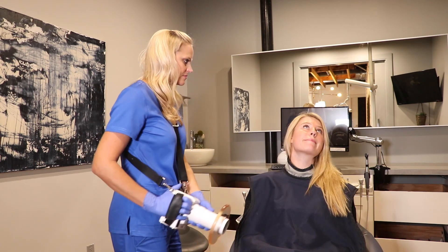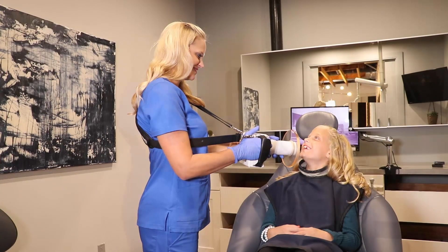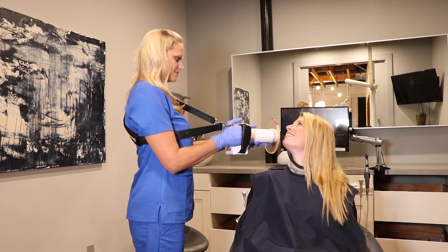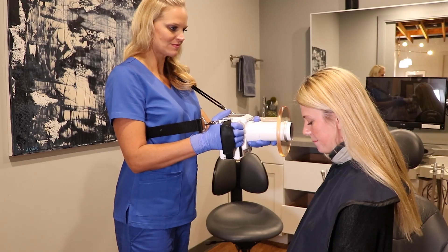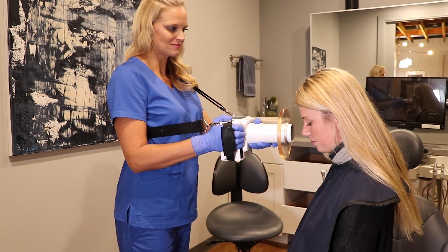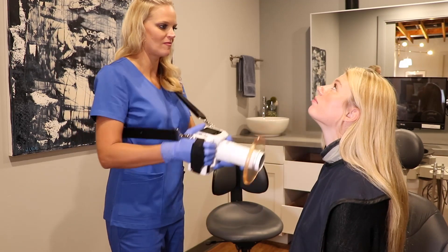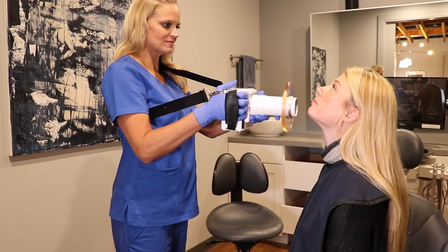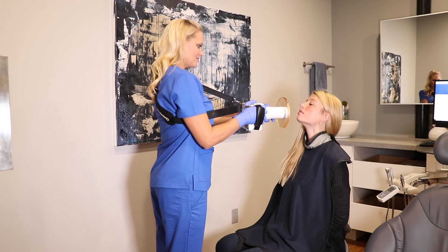There are multiple positions for anterior PA for adult and pedo. For adult: the anterior mandibular PA — patient will tilt their head up; the anterior maxillary PA — patient will tilt their head down. You can also turn the patient sideways in the dental chair to ensure the backscatter shield remains parallel to the operator. To take the full series, you may choose to place the patient in a stool where you can maneuver around the patient, maintaining proper position with each exposure.